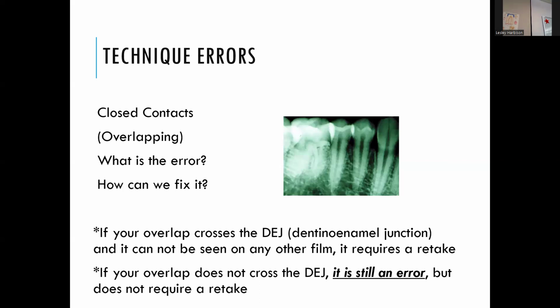Was there a question over here? No. Okay. So how do you fix it? I kind of answered that. Use the cotton swab. You will get to a point where you can eyeball the angle, and some of you may be there already. You can look at two teeth from an occlusal view.